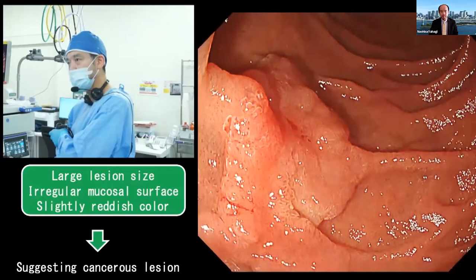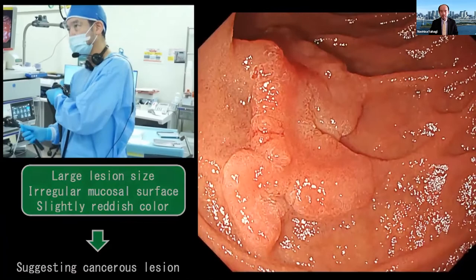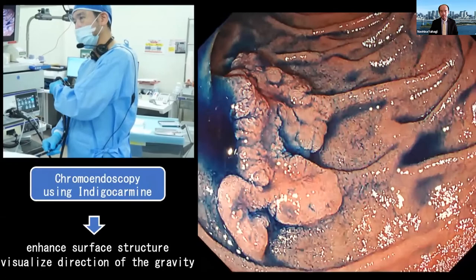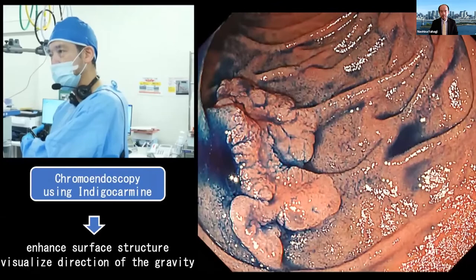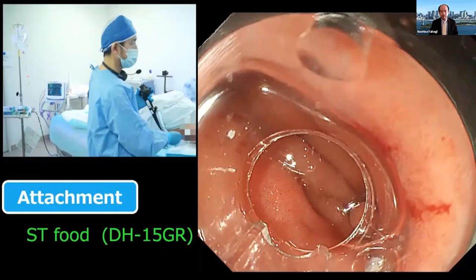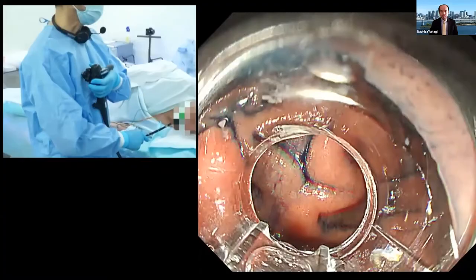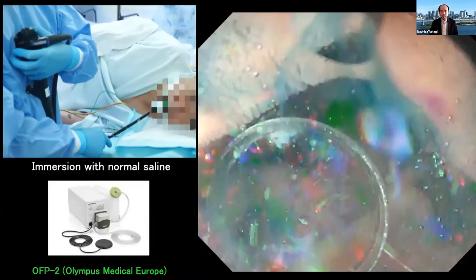There is certain irregularity and some redness on the surface, suggesting a cancerous component within this lesion. I always spray indigo carmine to enhance the surface structure, and we can recognize the irregularity of the surface even better. I would like to remove this entire lesion using the water pressure method. Now I'm introducing the cap-attached endoscope to the duodenum and we can see the target region, though maneuverability of the endoscope is really poor and unstable.